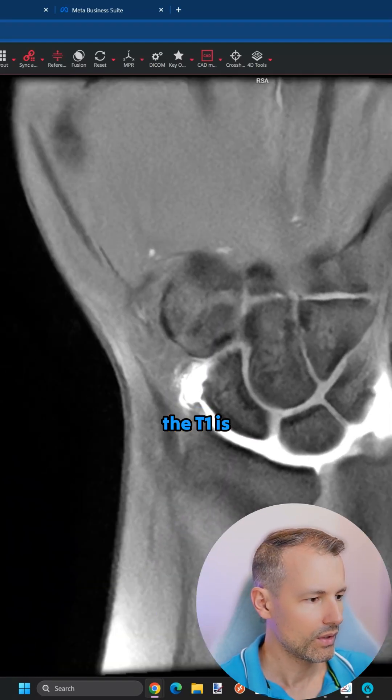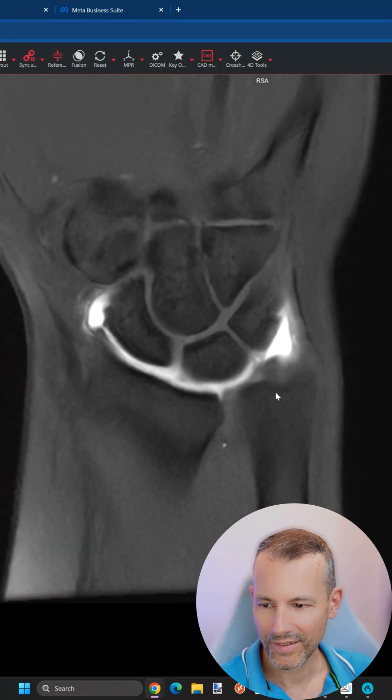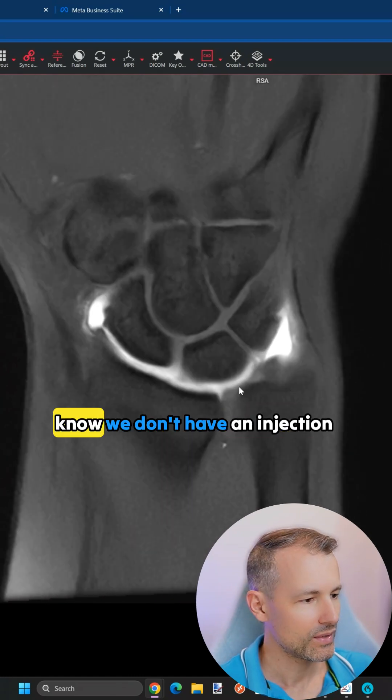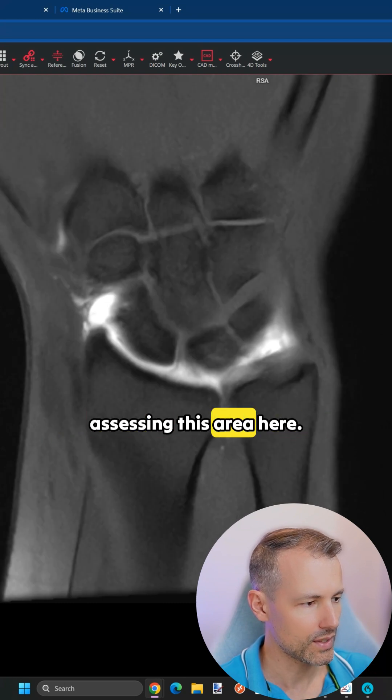The T1 images are not much better — sorry for the phone. Because we don't have an injection into the distal radioulnar joint, that might have helped us in assessing this area here.